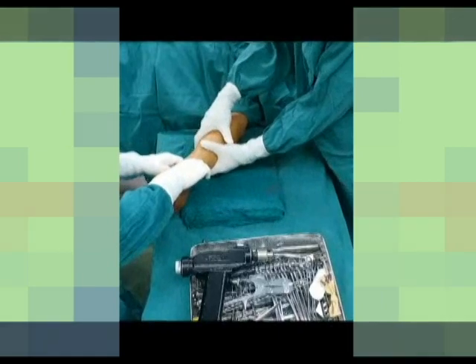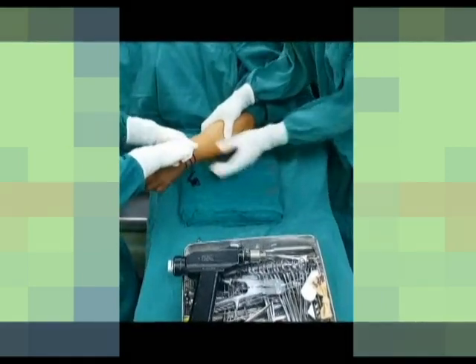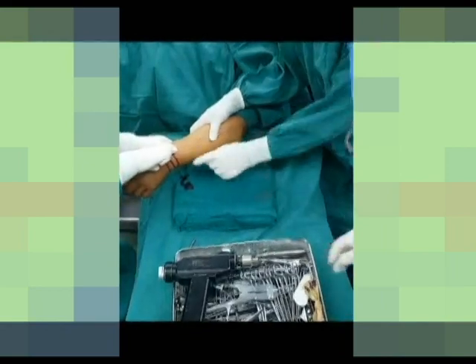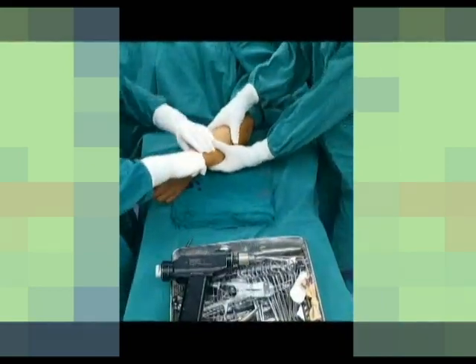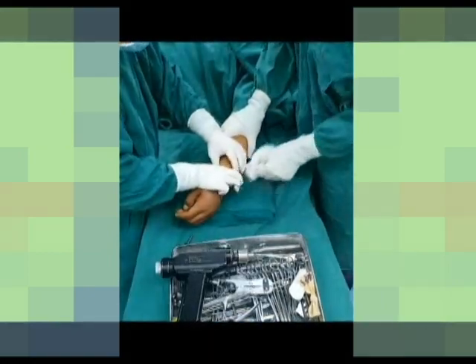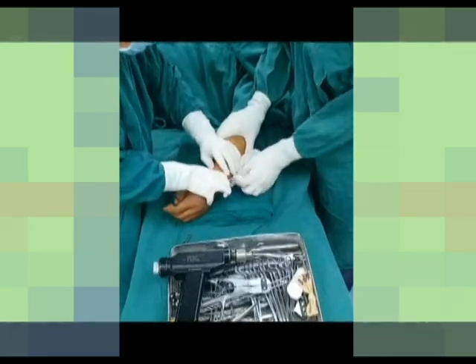A distraction force is gently applied on the two ends of the K-wire. The distraction force is oriented depending on the fracture patterns and the displacement, usually volarly with ulnar deviation. The fracture reduction is checked under C-arm fluoroscopy.